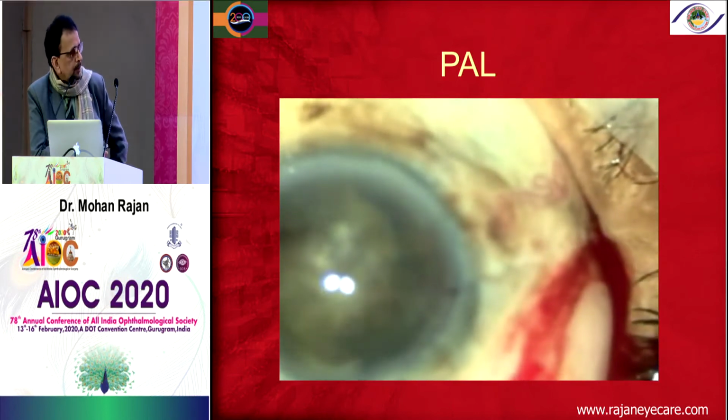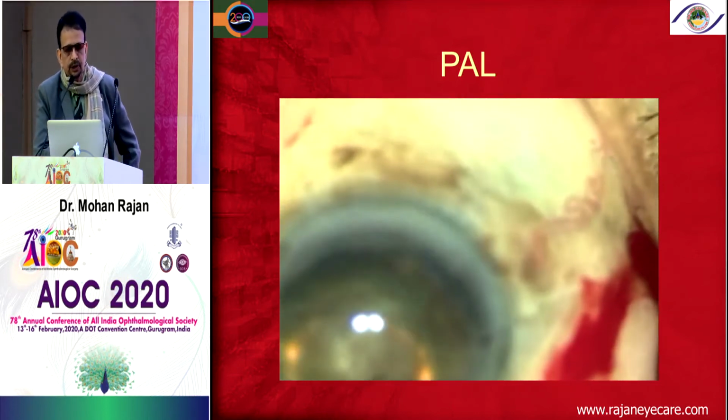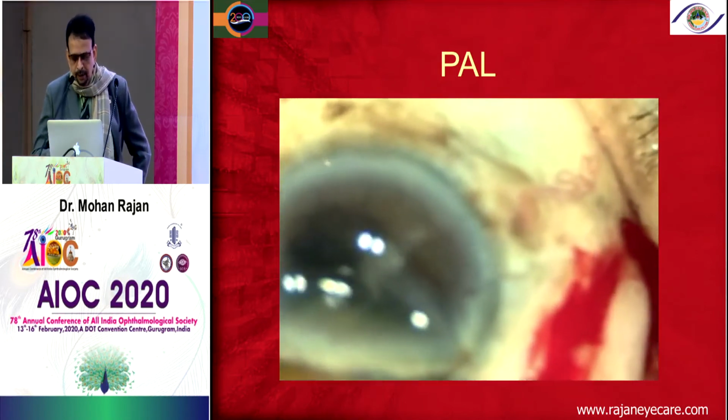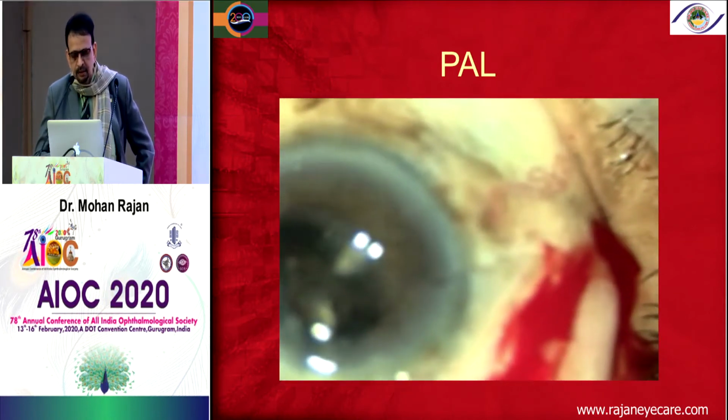You can see here how I'm trying to bring that up through the pars plana approach. That is called the posterior assisted levitation. Then you deliver it, and after that we did a glued IOL for this patient, the second sitting, and the patient did very well.